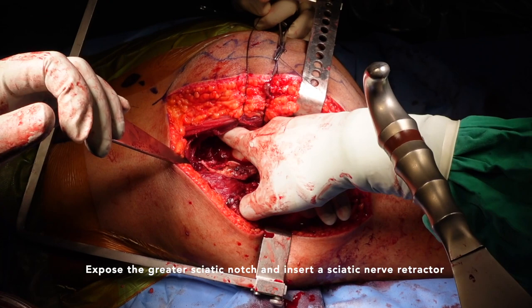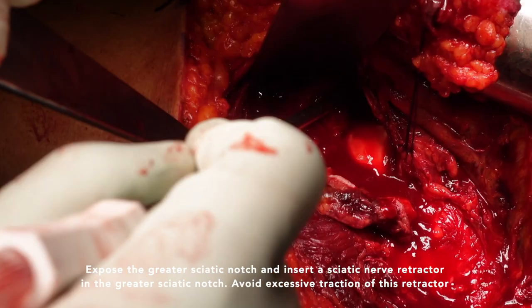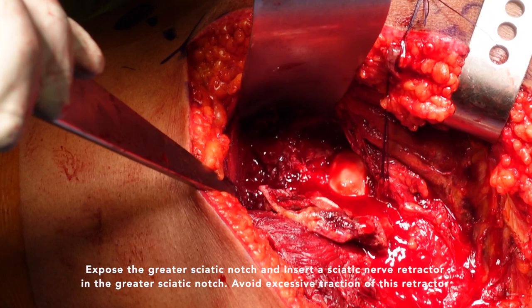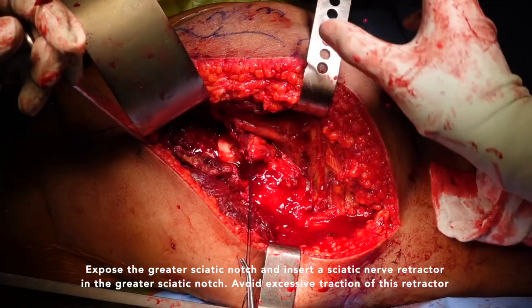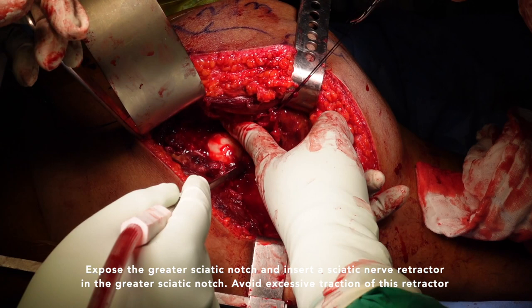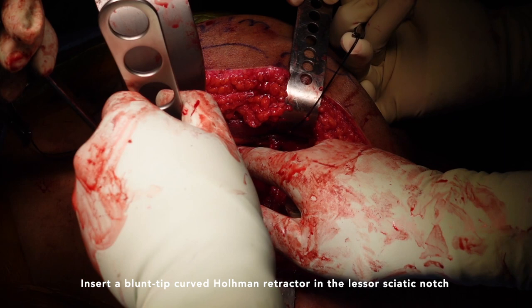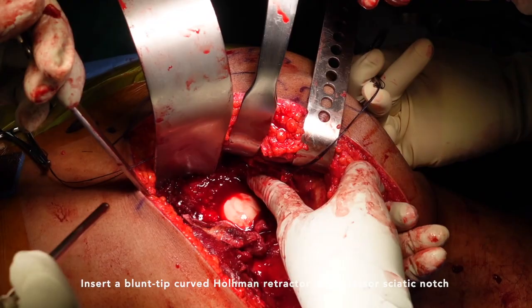Expose the greater sciatic notch and insert a sciatic nerve retractor in the greater sciatic notch. Avoid excessive traction of this retractor. Insert a blunt-tip curved Hohmann retractor in the lesser sciatic notch. Now the posterior column is fully visualized.